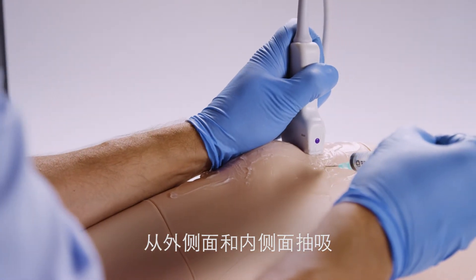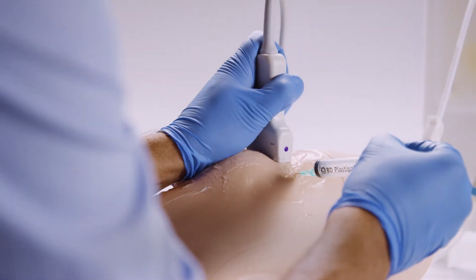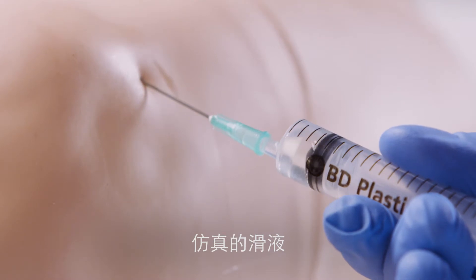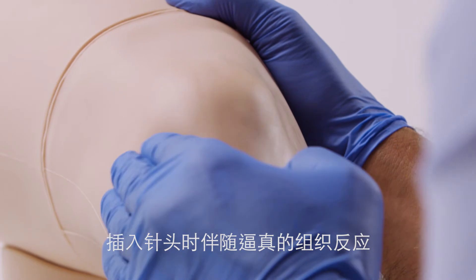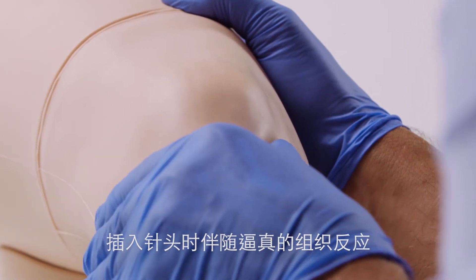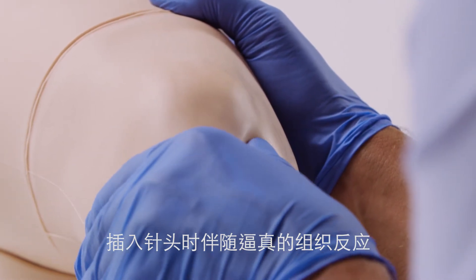Aspiration can be performed from both the lateral and medial aspects. The synovial fluid removed has a realistic color and consistency. The model has synthetic skin, muscle, and fat layers for a realistic tissue response when performing an injection.